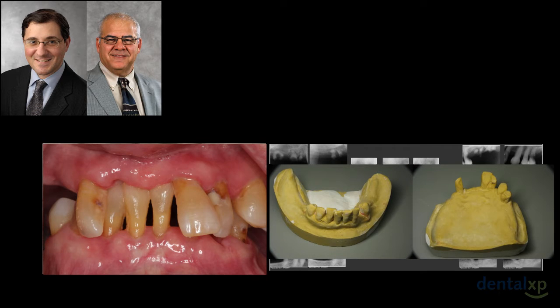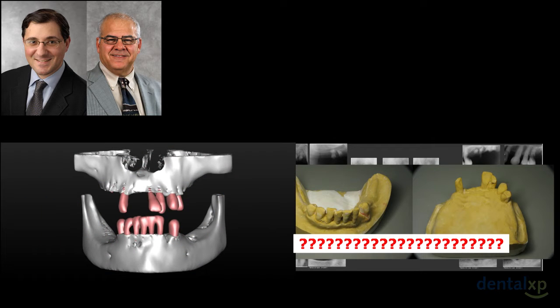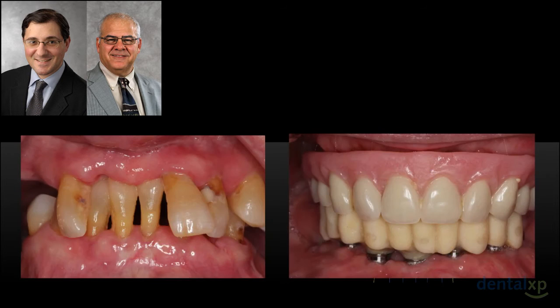Today we have cases where you take models and wonder what to do — maybe it sits on your desk for a while after taking a CT scan. With today's technology, doing a trial tooth setup, a virtual denture setup, and interfacing this onto the CT scan, we can do all of this on one CT scan to know exactly where the teeth used to be, where the new tooth position is going to be from a function and aesthetic standpoint, and where implants are going to go for immediate load surgery.